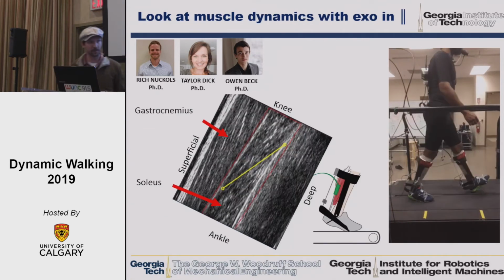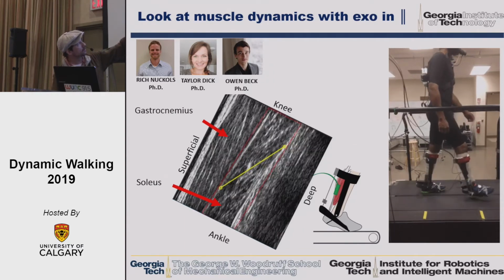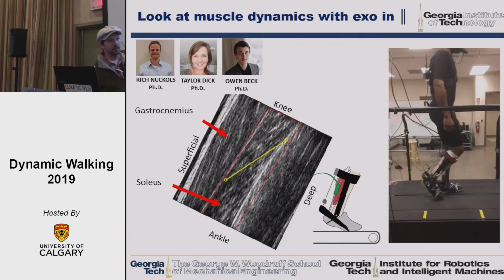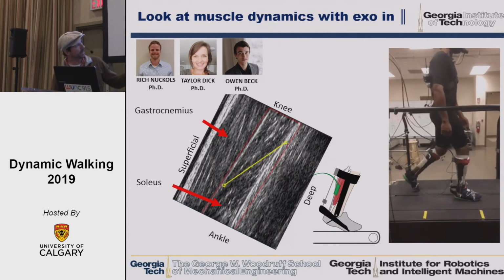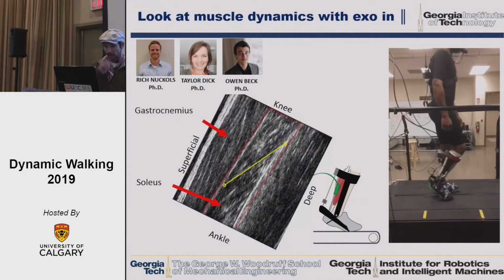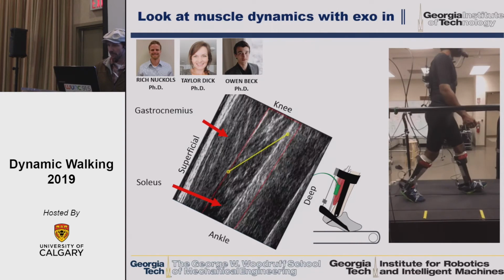This is kind of what an image that we get looks like. The yellow line is tracking a fascicle in soleus, which is deeper than the gastrocs, which are these superficial muscles that you can see. And so we calculate the fascicle length change directly from these images. Not calculate them, but make measurements of it.